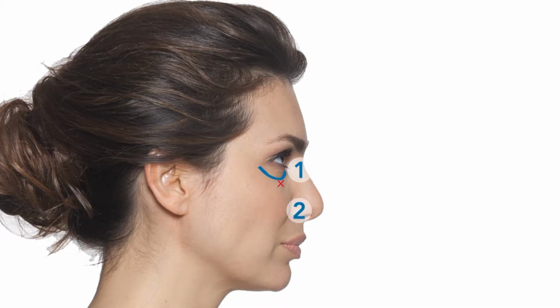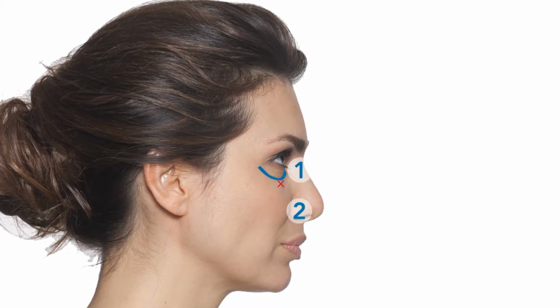First cheek apex line. Draw a vertical line from the lateral bony orbit 3 in an inferior direction. Second cheek apex line. Draw a line from the midline of the chin 4 through the oral commissure. This line will intersect the first cheek apex line at approximately the apex of the cheek.